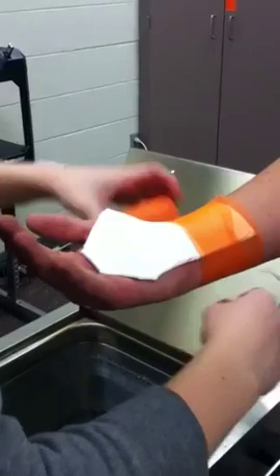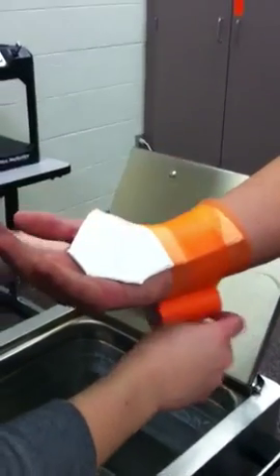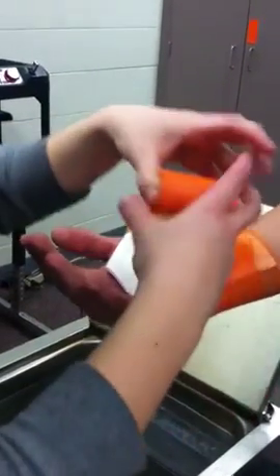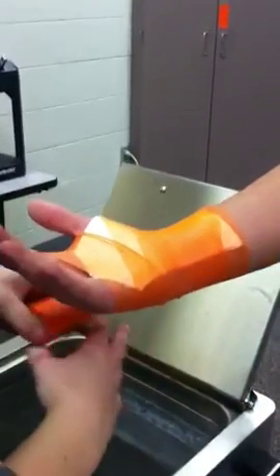You have to instruct the patient not to move, and she's going to apply the pre-wrap over. This will hold it in place. She's going to come up over the wrist and hand area through the thumb, and then she'll cut that.